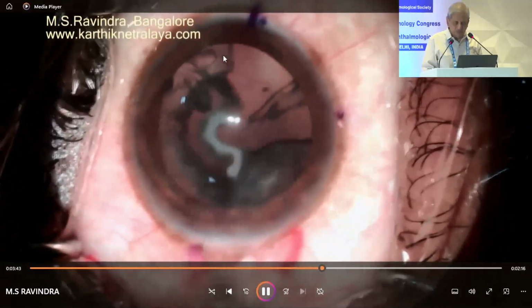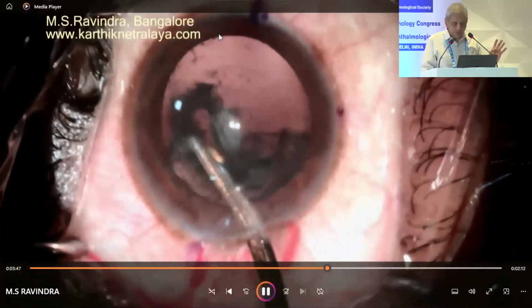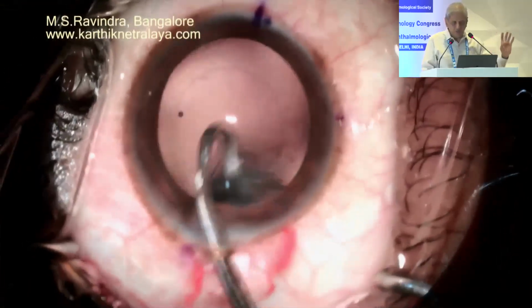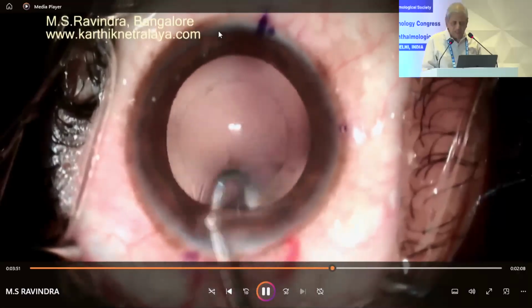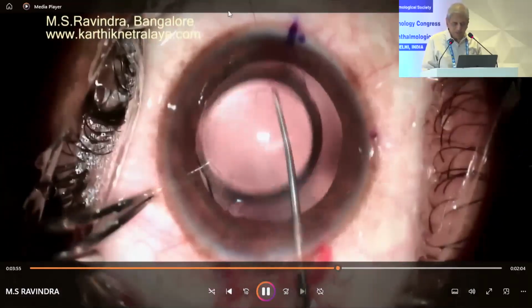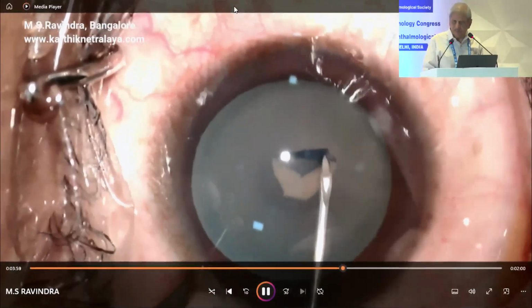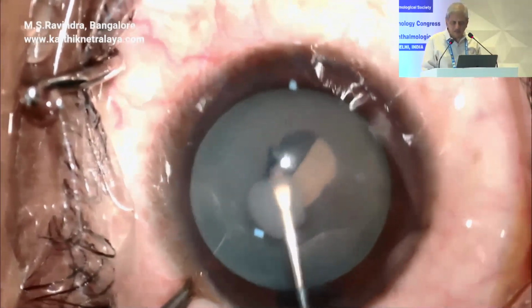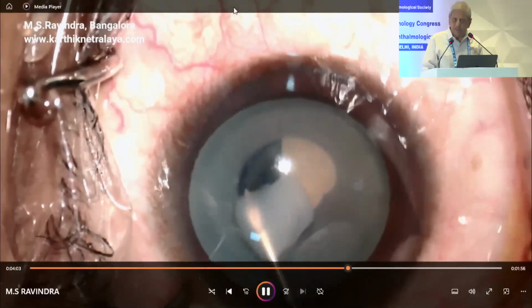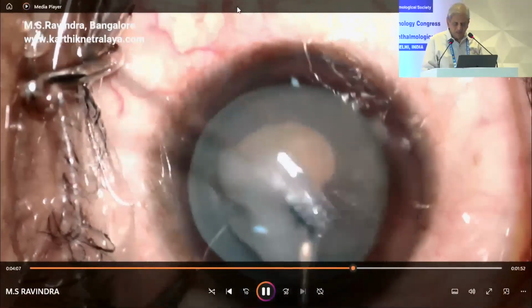So now you can see you should be very careful. Anterior chamber is very shallow, it's not deep, and I'm not pushing because the pressure in the entire eye is atmospheric or less than atmospheric right now. I could put a lens, and without any problem I could have completed the surgery. So this is one good indication for SICS where you suspect posterior capsule to be dehiscent or potentially weaker.